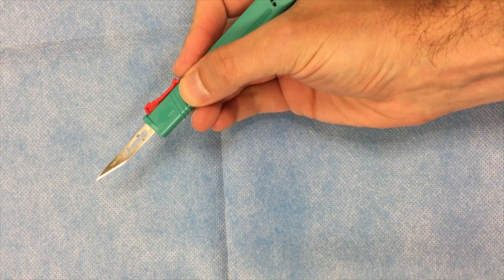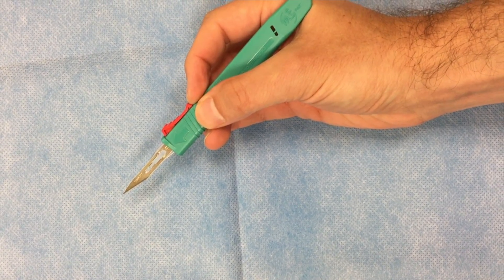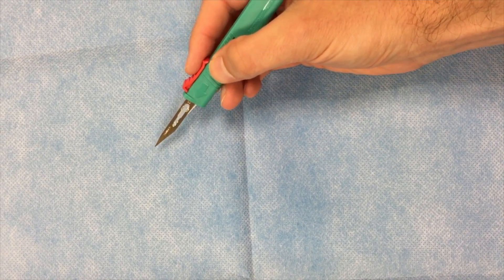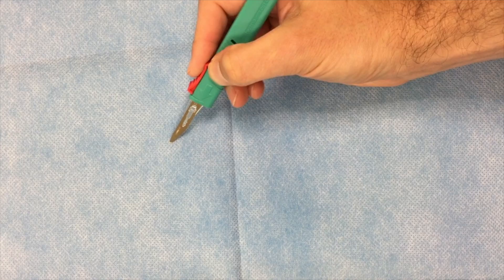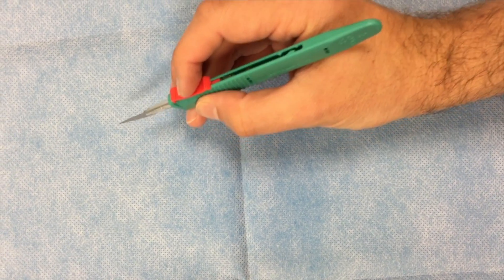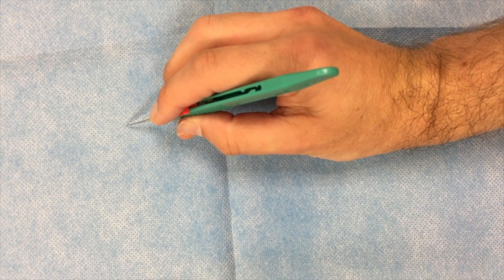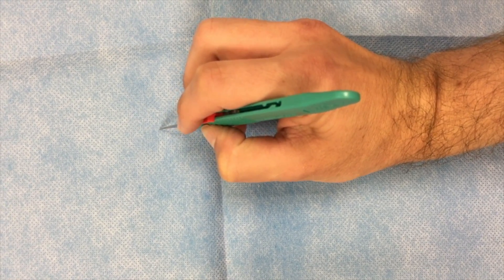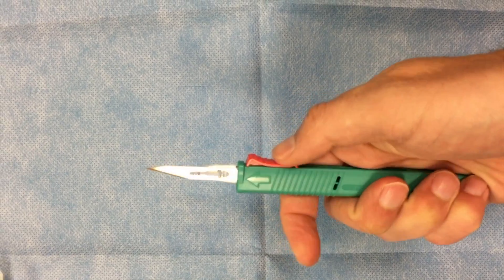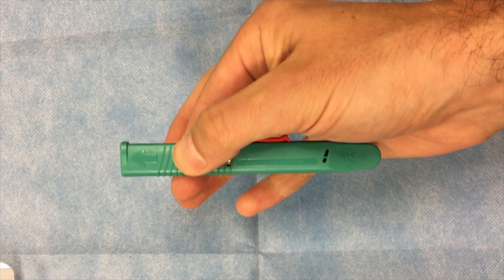You can rest your fingers underneath on the patient's skin to give your hand something to hold on. Imagine for a port — let's say we're making an incision right there. You rest the palm of your hand on the patient, hold the blade like a pencil, and then you can make your incision through the patient. Make sure whenever you use a sharp to put it back or notify people if there's an open sharp on the table.